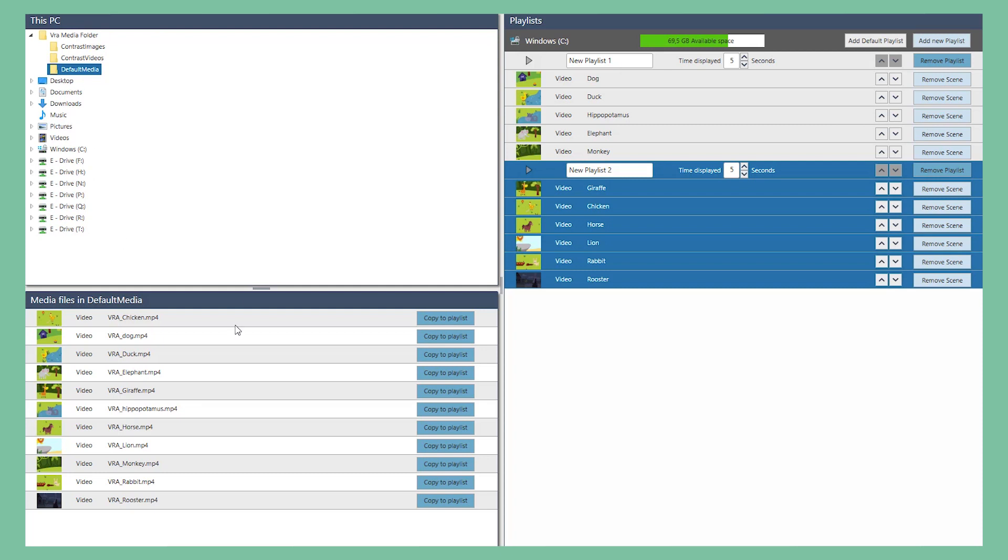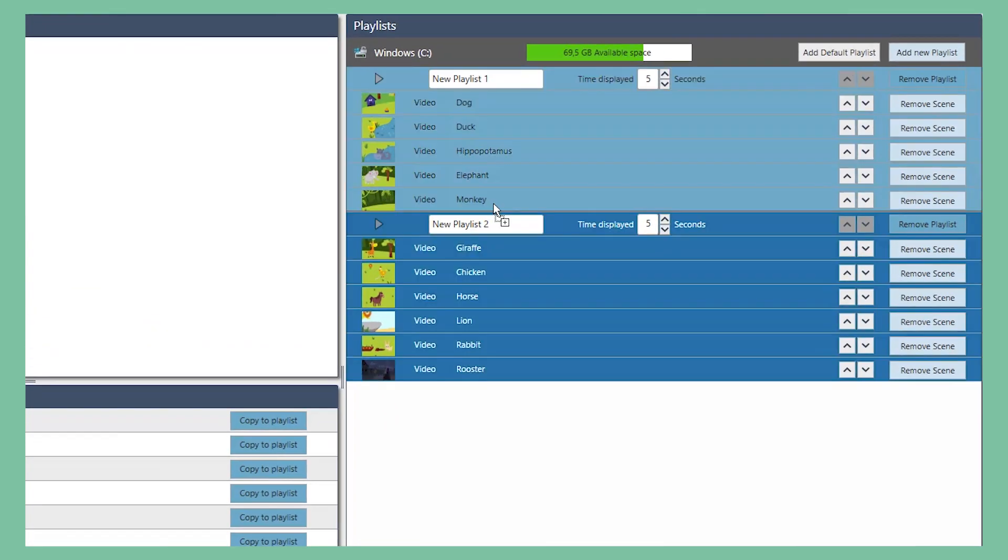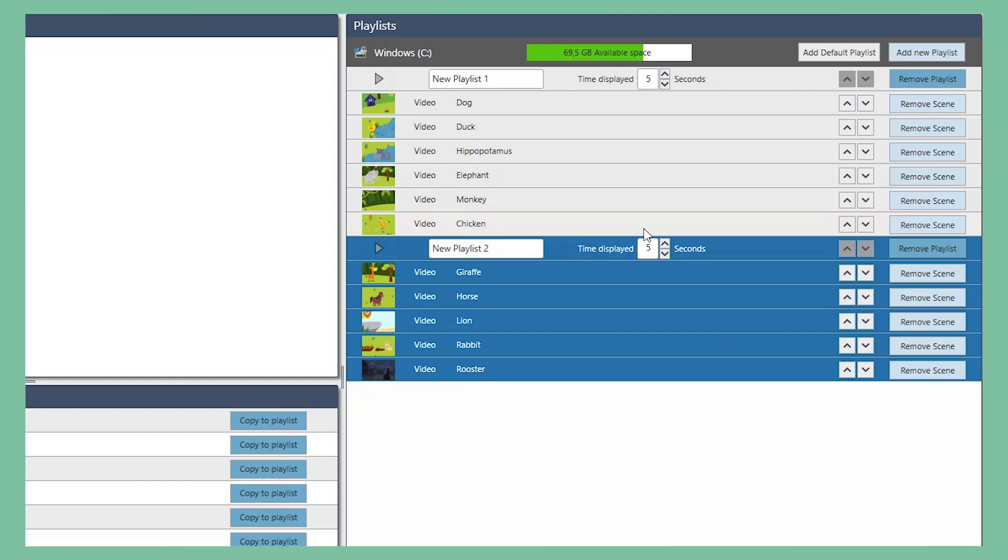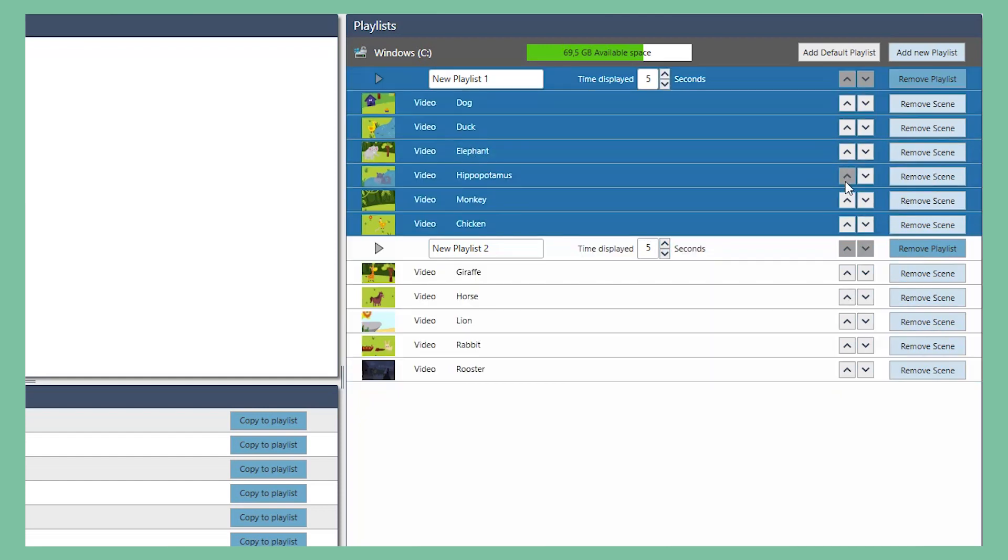Drag and drop images and videos between the playlists to arrange them the way you want, or change the order in which to play them. Use the arrows to change the order of your content.